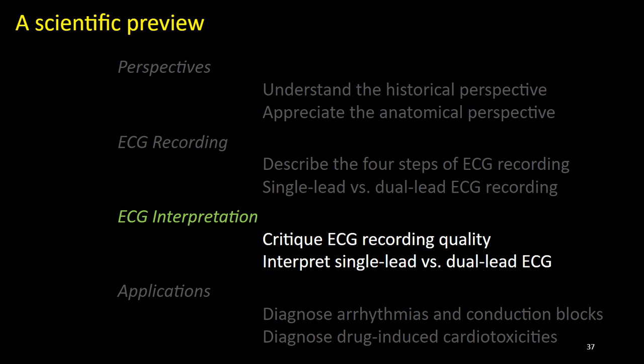For the adult zebrafish, we find the following setting to yield consistent and satisfactory signal-to-noise ratio: range of 2 mV, low pass at 120 Hz, high pass at 0.03 seconds, at a sampling rate of 1 kHz. Lastly, in preparing the zebrafish test subject, as we have just discussed, anesthesia is key to suppress motion artifacts. Those are the 3 ways that we can use to reduce noise.